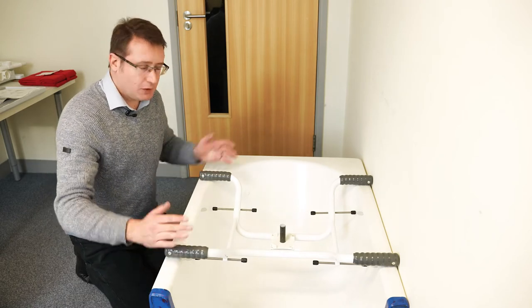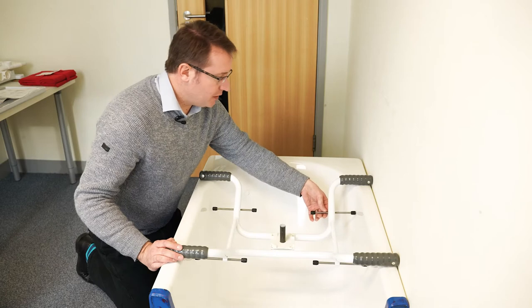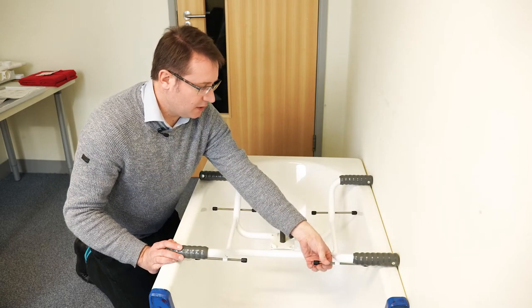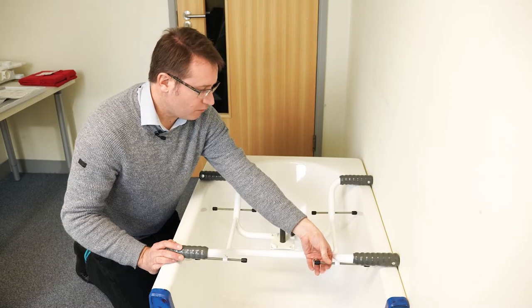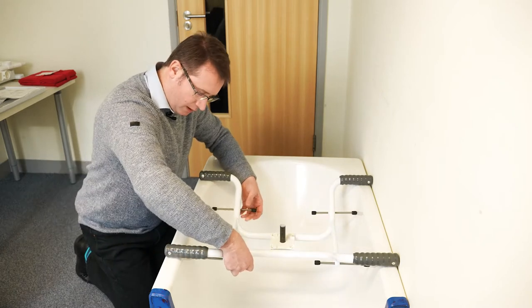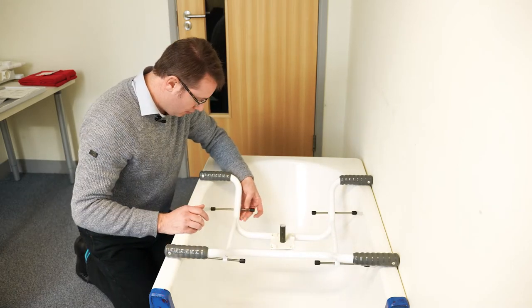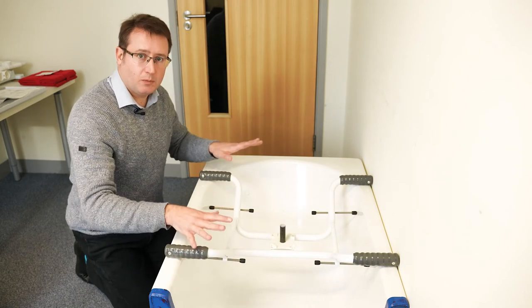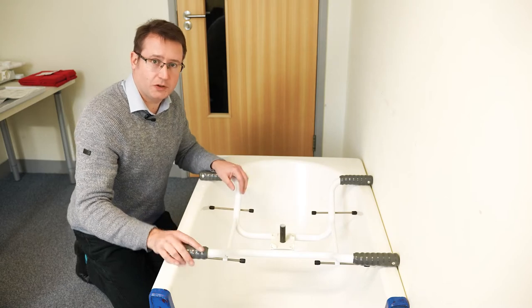Once you've adjusted the frame to accommodate the bath width, the positioning screws simply adjust out just so they touch the inside wall of the bath. That stops the base frame moving around on the bath at all, making it more secure.